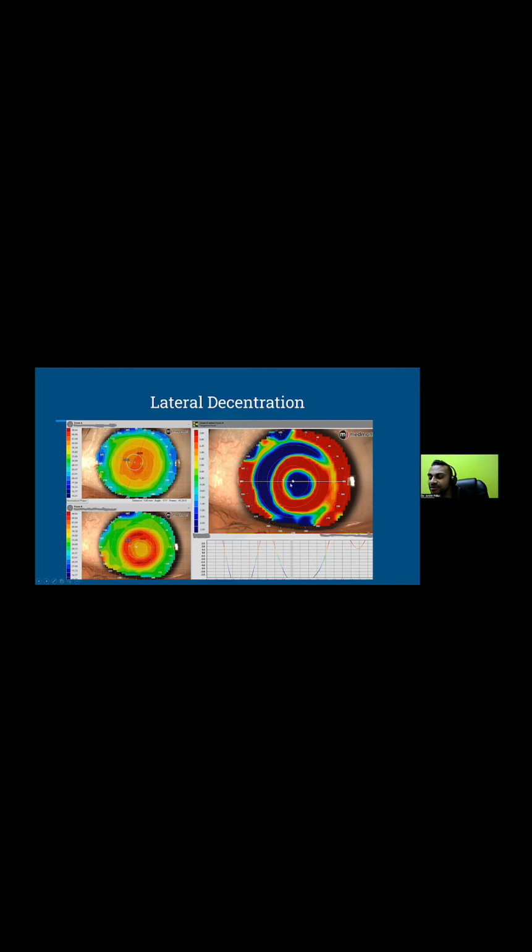So I could have convinced myself here to say, well, in this quadrant, I'm going to steepen the alignment zone only. Sorry, not steepen. I'm sorry. Flatten the alignment zone only to land closer to the cornea to get that 360 alignment. I could have convinced myself of that. That's what I'm thinking just looking at the topography, because that's what it looks like. But I saved myself a lot of headache by doing the fluorescein pattern and saying, hey, I was probably too small. So I started there.